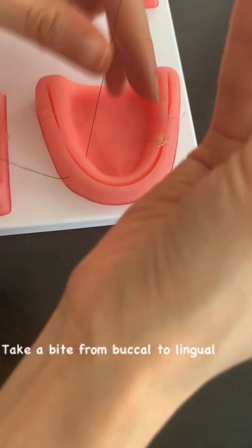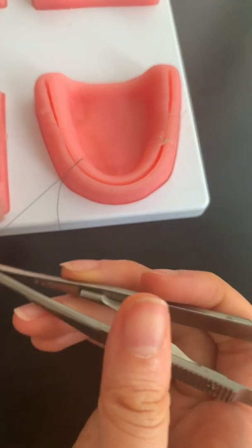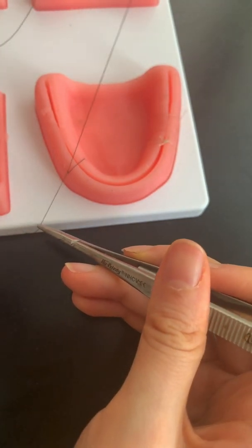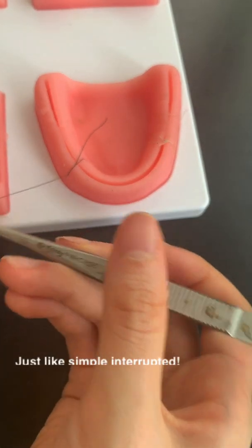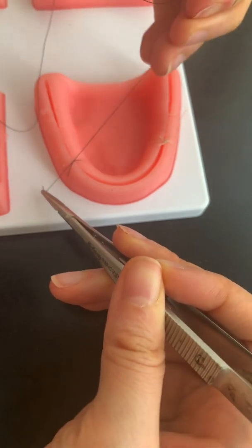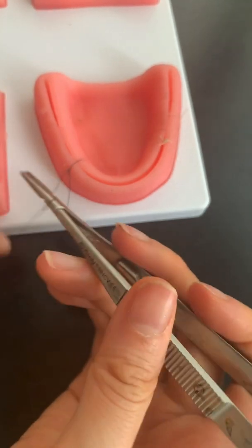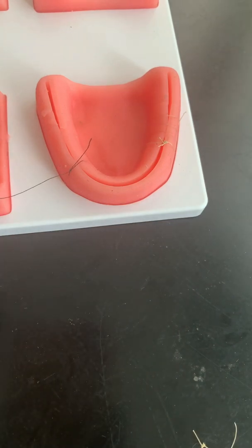Take a bite from the buccal to the lingual and you would tie it as if you're doing a simple interrupted. And instead of cutting it, you continue — that's what makes it continuous.